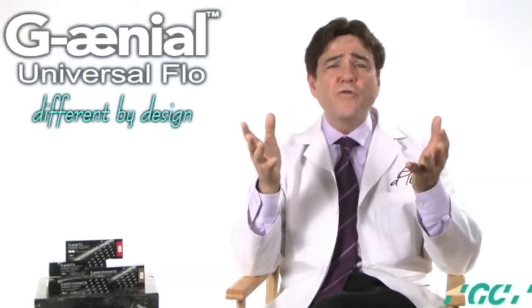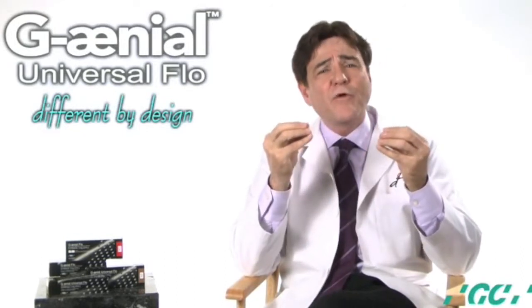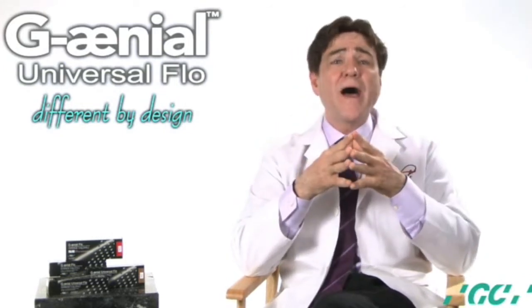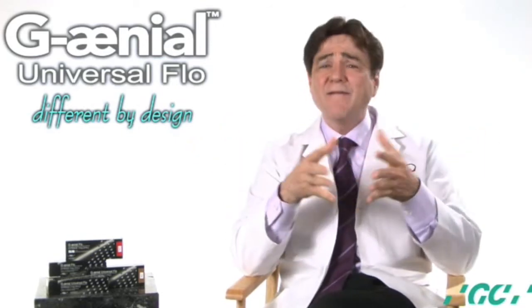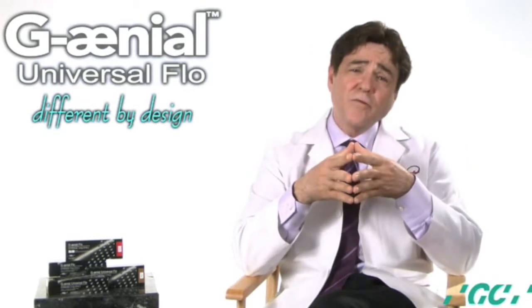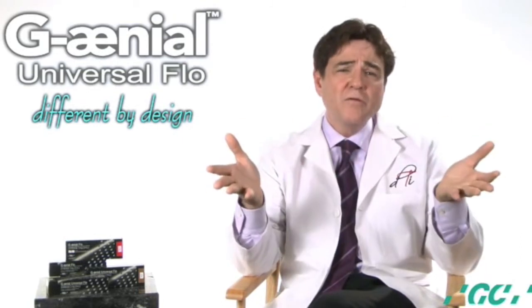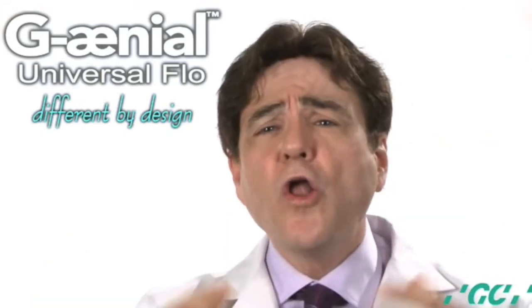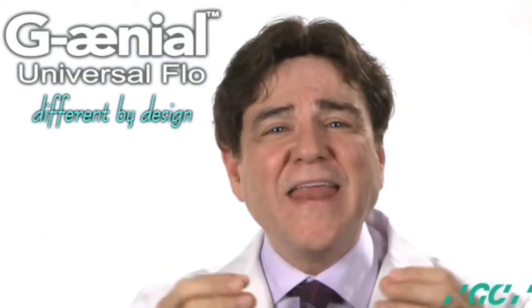Although this biomaterial, Genial Universal Flow, has so many potential uses, the selection of the proper material for any particular clinical situation requires many consideration factors, including the biologic, physical, and mechanical properties of the material, the placement technique, cavity configuration, anticipated margin placement, curing light intensity, tooth anatomy and position, occlusion, patient's oral habits, and ability to isolate the operative field. All of these factors have the potential to influence the clinical behavior and material performance, and each should be considered prior to restorative treatment.